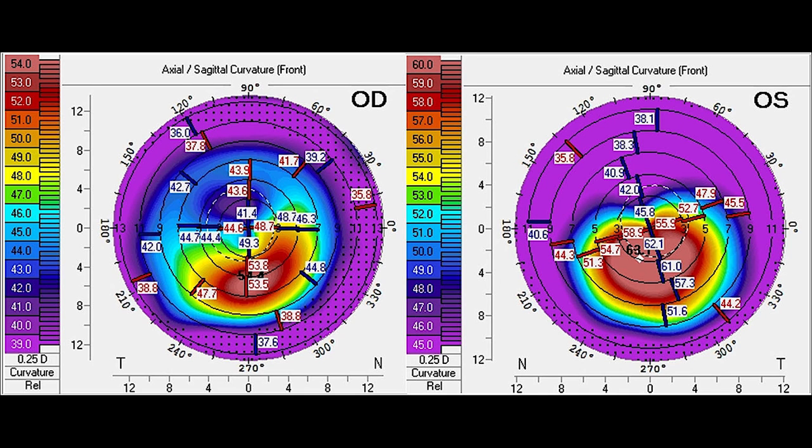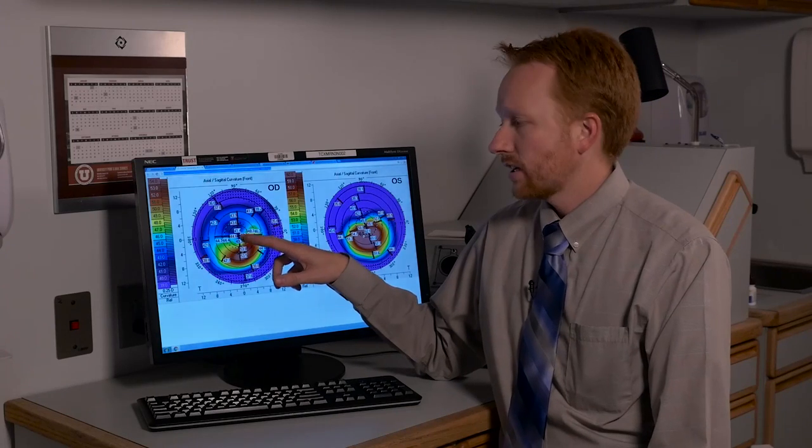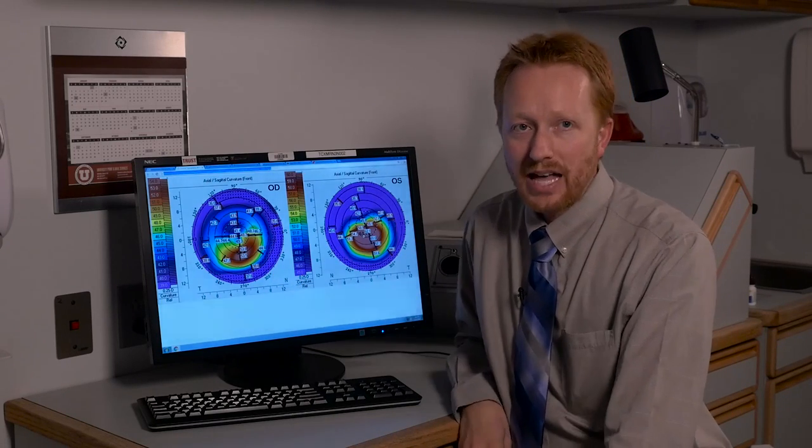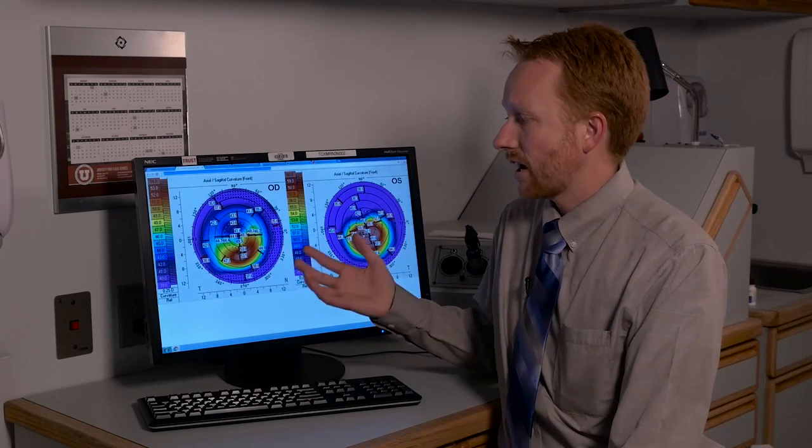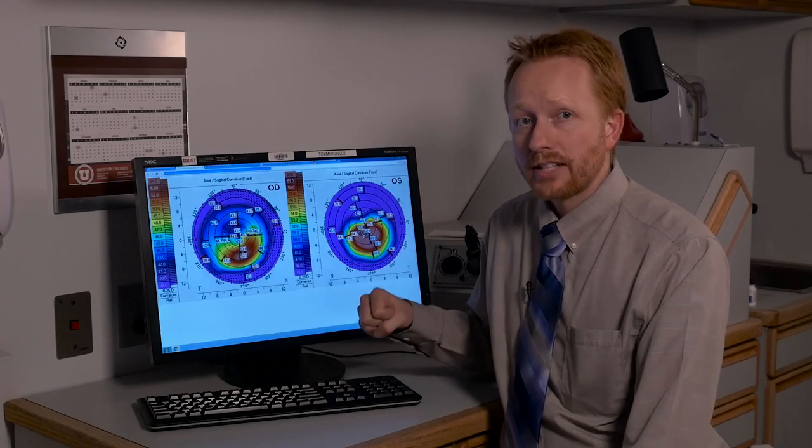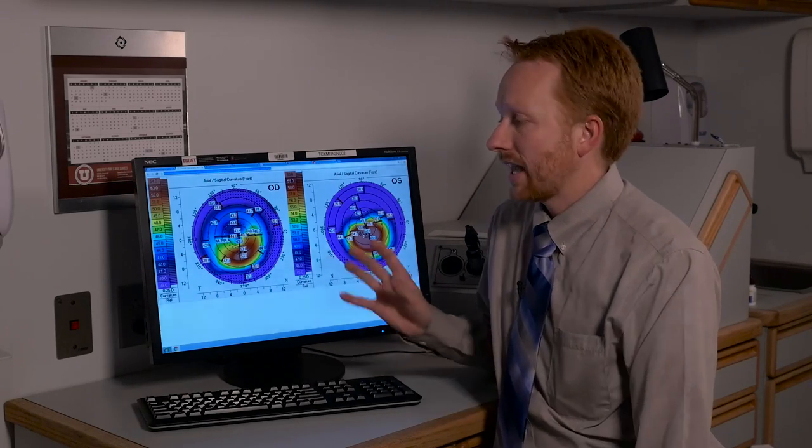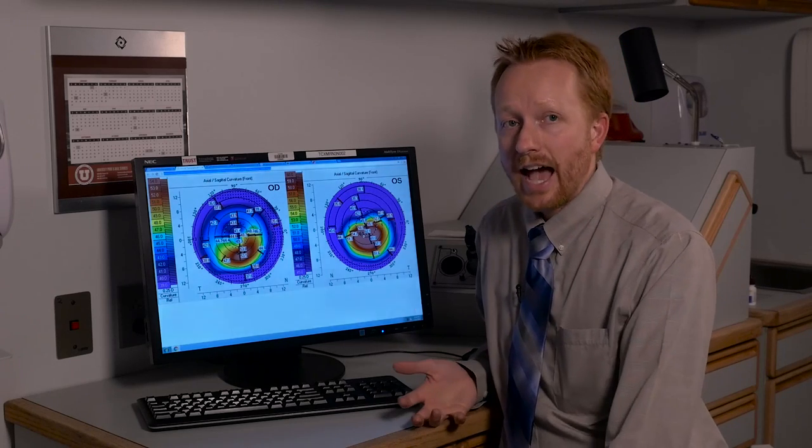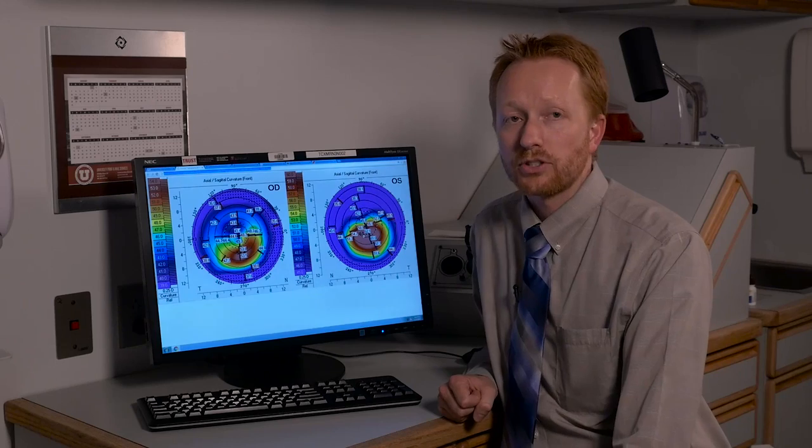This patient has one area of very steep cornea at 54 diopters, and you can see surrounding that it flattens out with a very flat area just superior to the visual axis. This is a very irregular pattern. This is someone who has keratoconus and the challenge will be, whether it's glasses or contacts, to try to minimize ghosting and double images. In a case like this, a gas permeable contact lens would be the ideal way to reduce these symptoms.